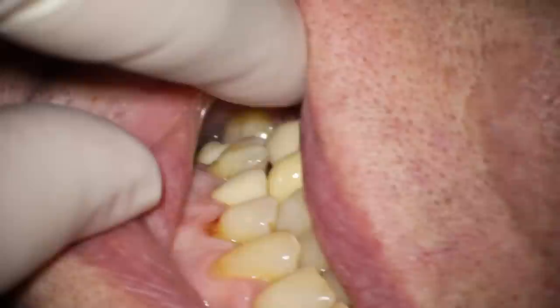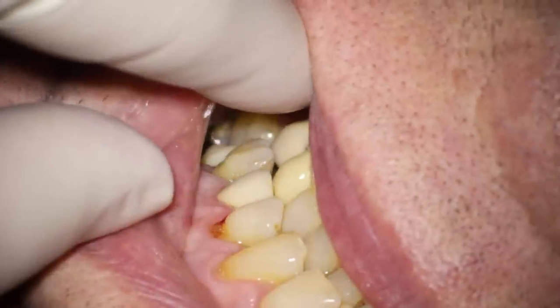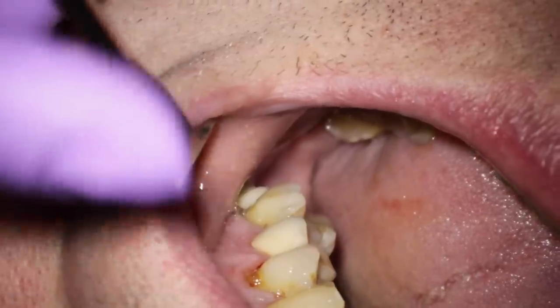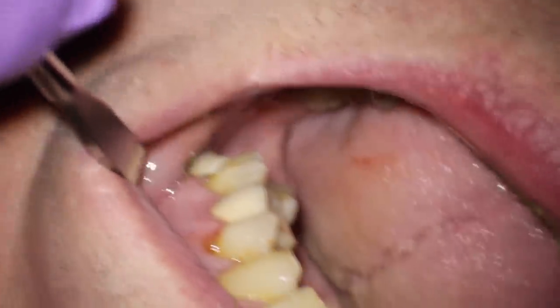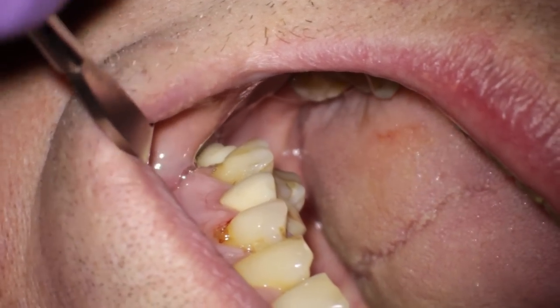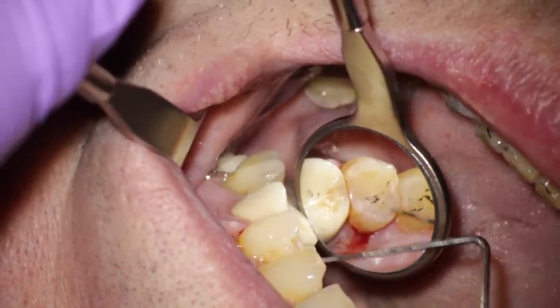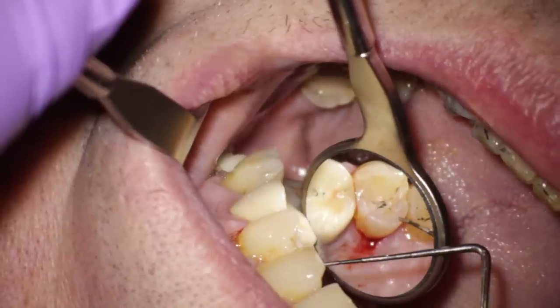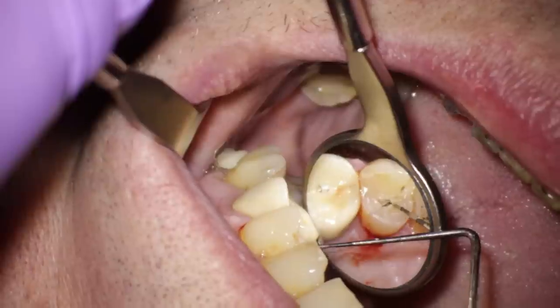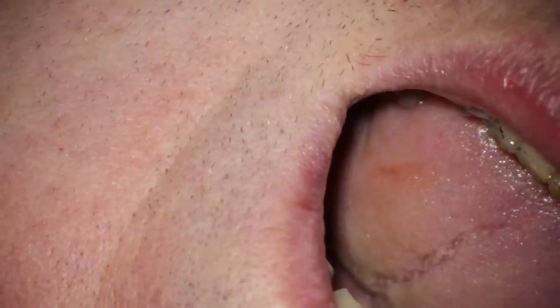You can see the patient bites on this tooth and when biting, the tooth is intruded — a side shift is visible. You can also see traces of bruxism on the palatal cusp, which might be the reason why this tooth became diseased.